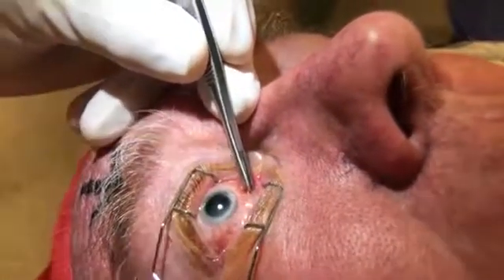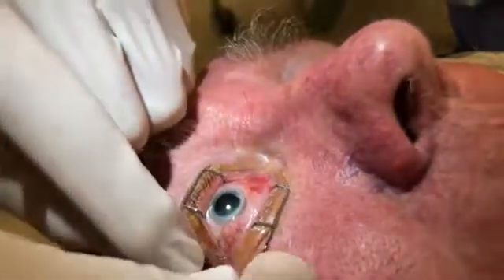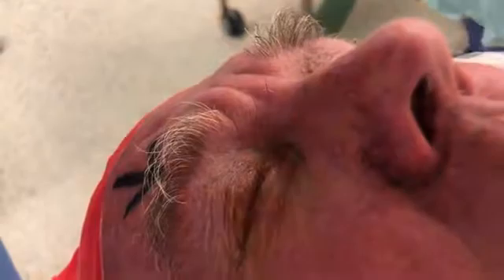Now I'm taking that out. I'm going to remove the clip, and you just close your eyes now. Cut!